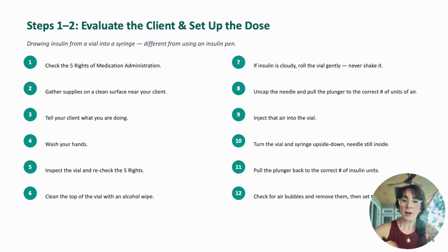You're going to clean the vial with an alcohol wipe. If the insulin is a cloudy type insulin, I want you to roll it between your hands. Do not shake it. Shaking it can induce air bubbles into the product, and it makes it much harder to draw up the correct amount.